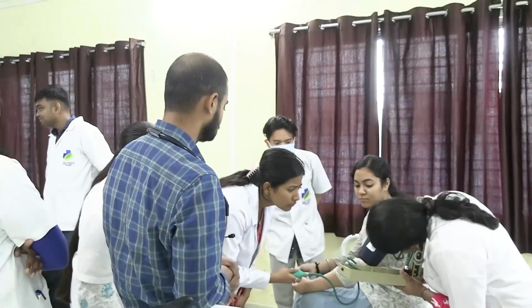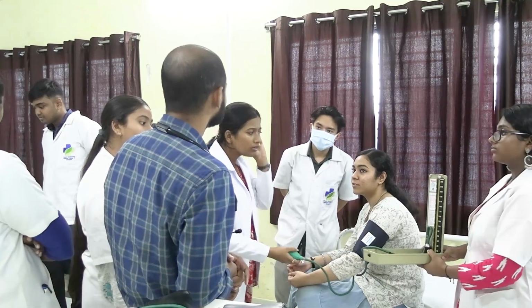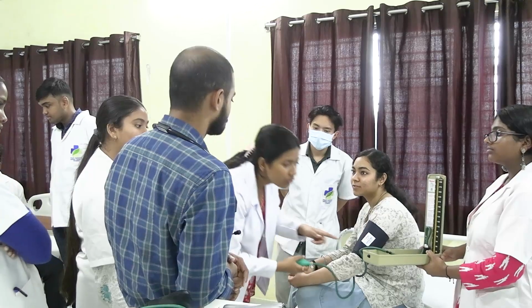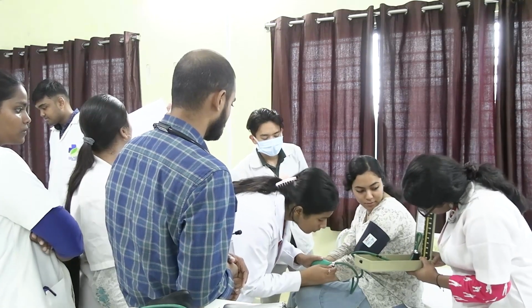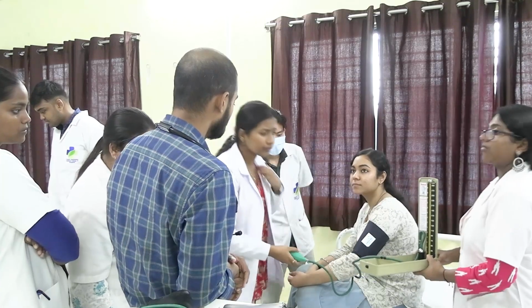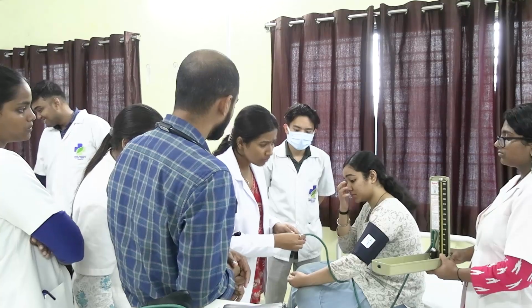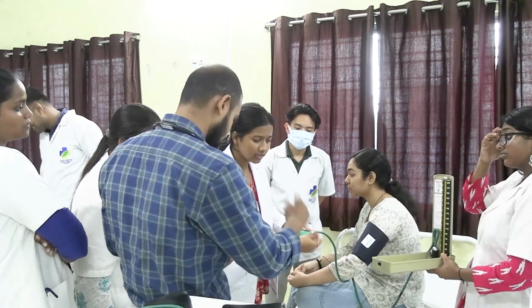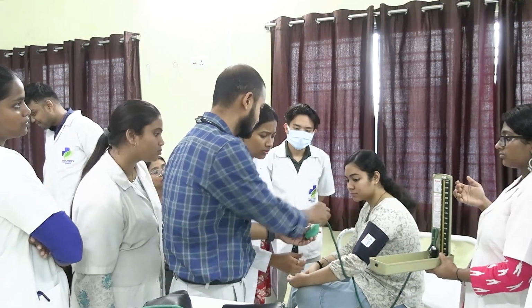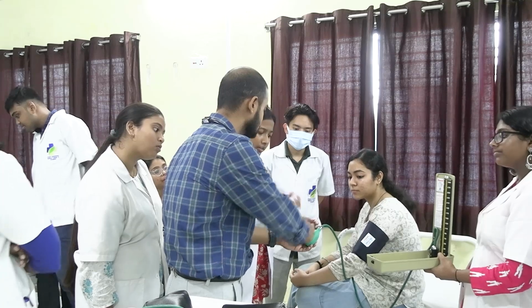Now. Wait. First we have to set it to 0. It's already at zero. Okay. Now you have to tighten the valve, otherwise it will deflate. In which direction is it tightened? Like this. If it is like this, then the clockwise direction is tightened, and anti-clockwise it is relaxed.